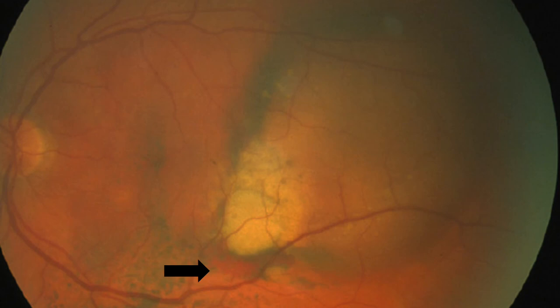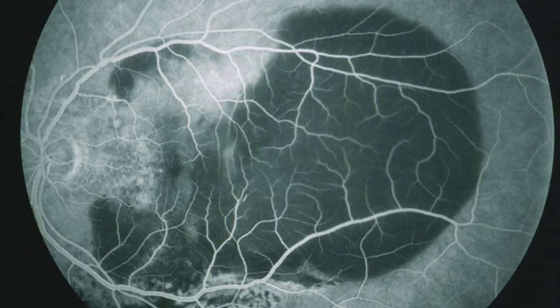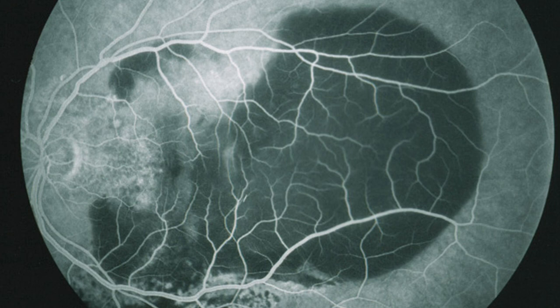Note the fresh hemorrhage at the edge of the tumor at the end of the arrow — a very uncommon finding for choroidal melanoma or metastasis. Note the 'blackout sign,' which is almost pathognomonic for choroidal hemorrhage. The blood is blocking out the normal choroidal fluorescence. Like RPE, hemorrhage blocks the normal choroidal fluorescence. But how do we differentiate RPE hypertrophy from choroidal hemorrhage?